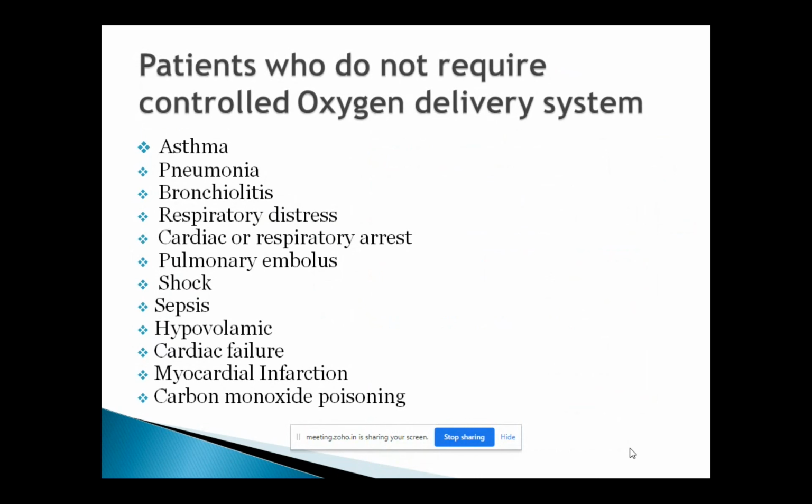So we need to know which patients do not require controlled oxygen. For example, all the devices, nasal cannula, simple face mask, non-rebreathing mask, or partial rebreathing mask, come under uncontrolled oxygen delivery systems. The reason is you can only tell how many liters you are giving, but you cannot tell what percentage the patient is achieving. Even if you're able to tell the percentage, there is only a variation. You may be able to say the patient is getting 50 to 70 or 50 to 90, but you can't specifically say how much FiO2 the patient is getting.